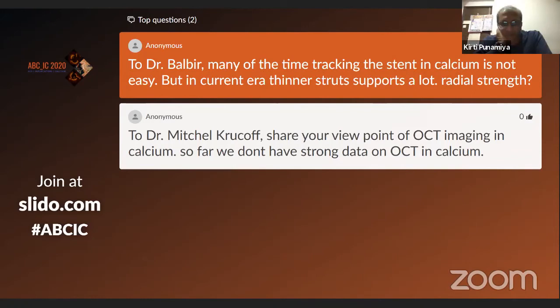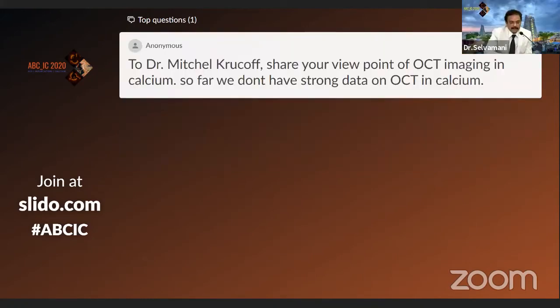Kirti sir, do you have any suggestions, like in which type of stents we have a high incidence of LSD? Is there any specific reason, or what is your experience in this stent deformation, longitudinal stent deformation? So I think as far as I'm concerned, there are two types of stent deformation. One, which is the most frequent, is at the proximal end of the stent.